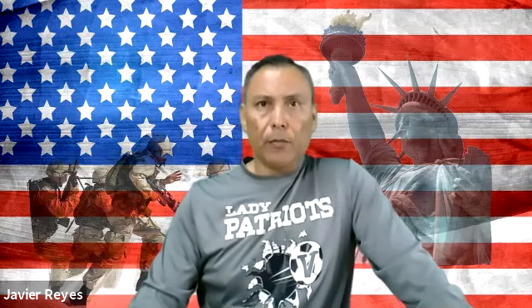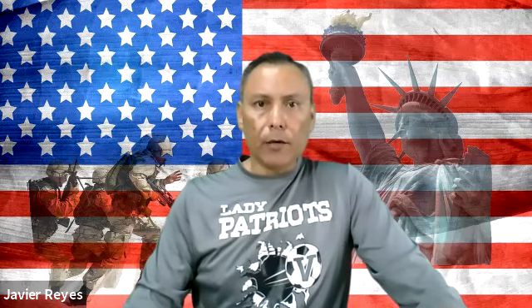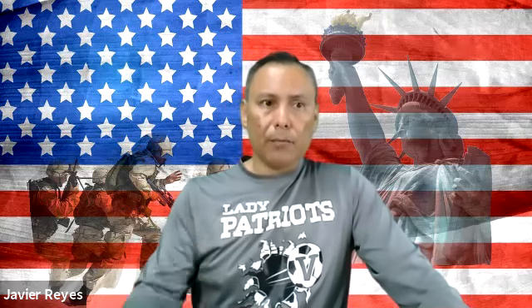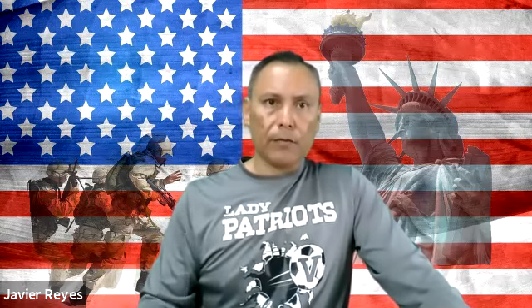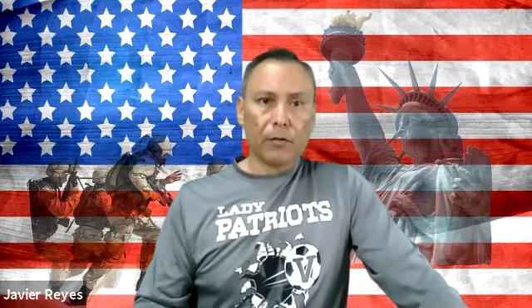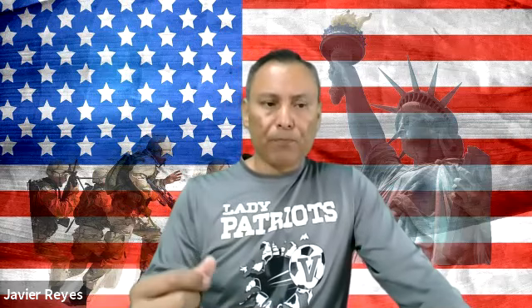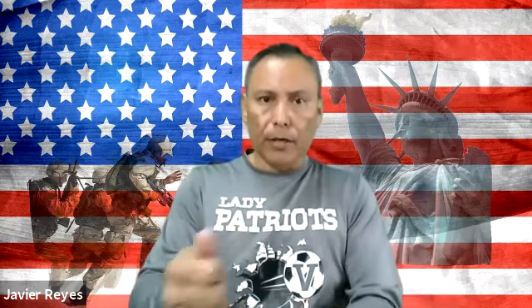All right, so we continue here in the last section of chapter 12. You need to be familiar with what an aliquot is. It's a strange word, even to pronounce, but it's a sample from a blood specimen. Once you bring the specimen to the lab, somebody in the lab is in charge of removing the stopper, the cap of the tube. So you have to be very careful.